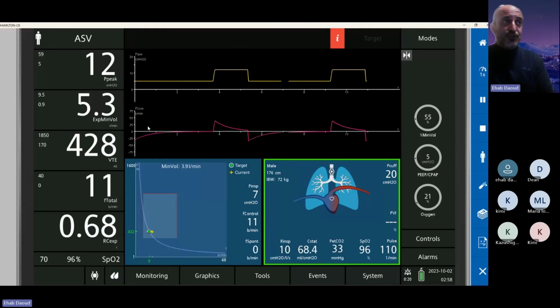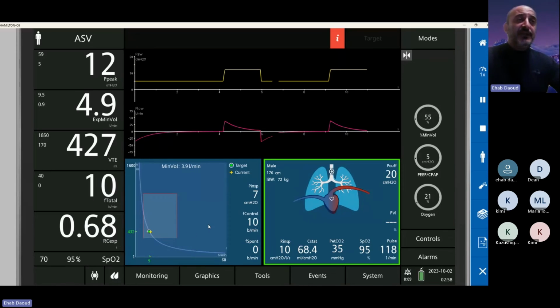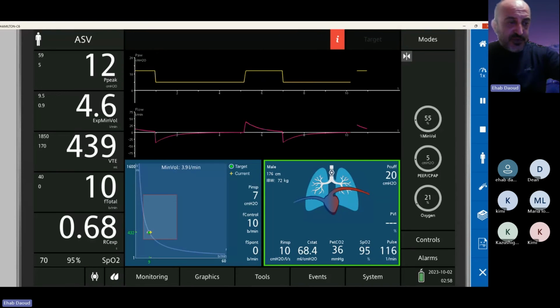You don't have to switch to pressure support, because most of the time, if the patient is triggering all the breaths, it will be a spontaneous breathing trial. Again, of course, it's more complicated than this in adaptive modes, but this is just a quick overview about them.